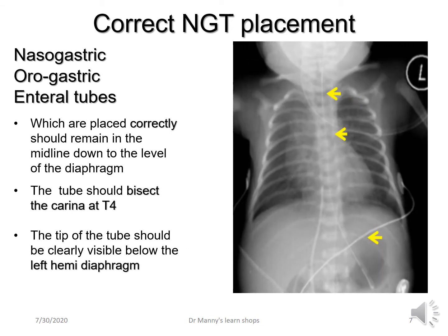As is indicated, radio-opaque line, midline bifurcates or bisects the carina and enters the stomach approximately level to the diaphragm. Radio-opaque tip at the end.